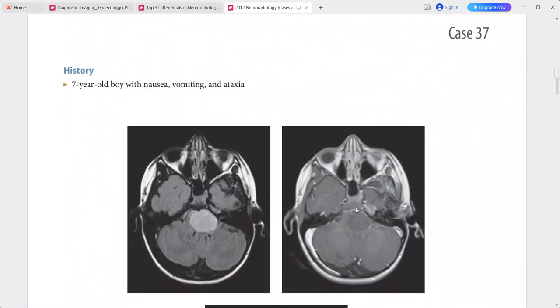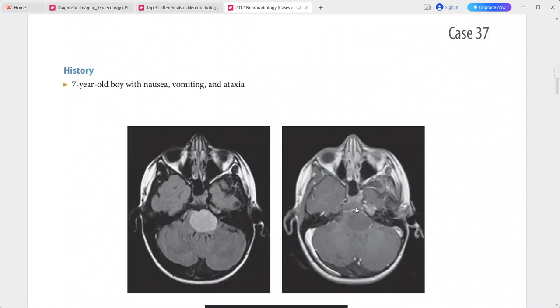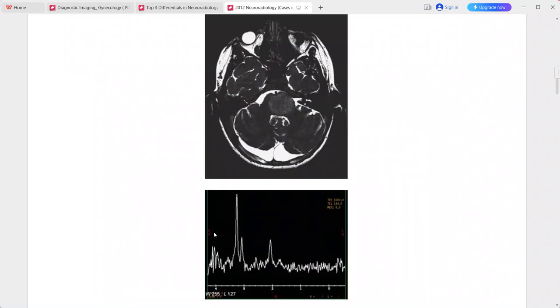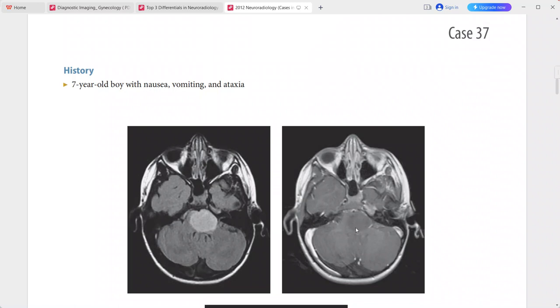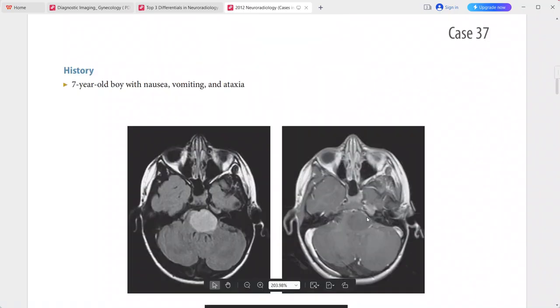Next: a 7-year-old boy presenting with nausea, ataxia, and vomiting. There is an expansile, well-demarcated, T2-hyperintense mass centered within the pons. On post-contrast sequence there is no abnormal enhancement.